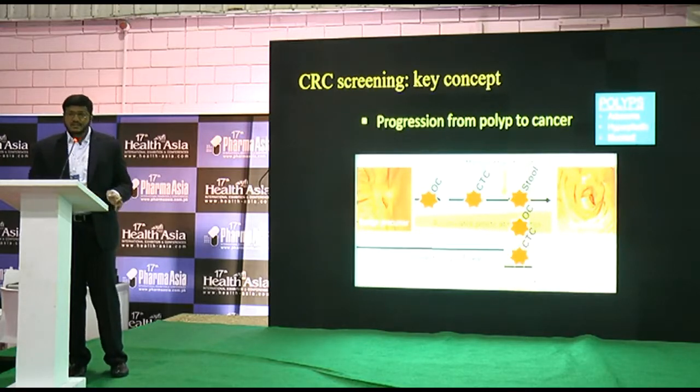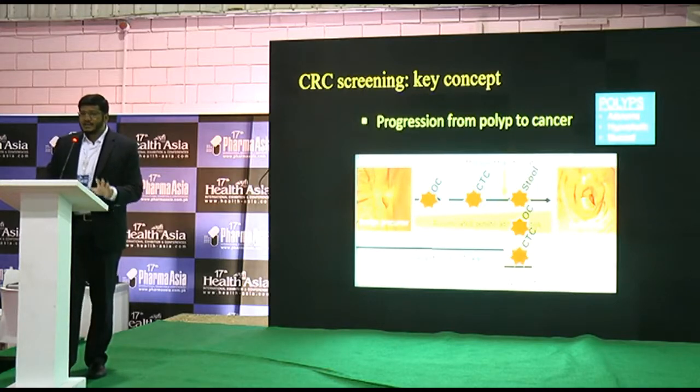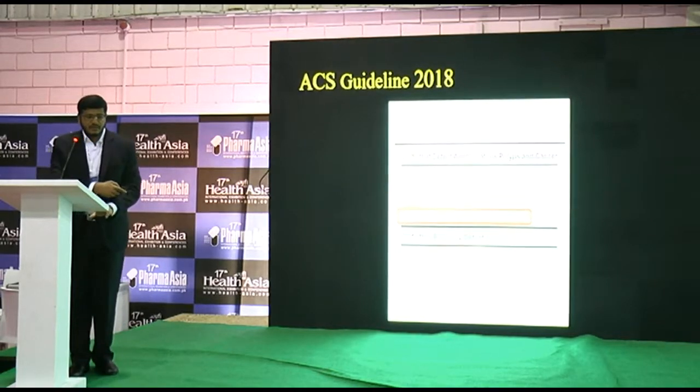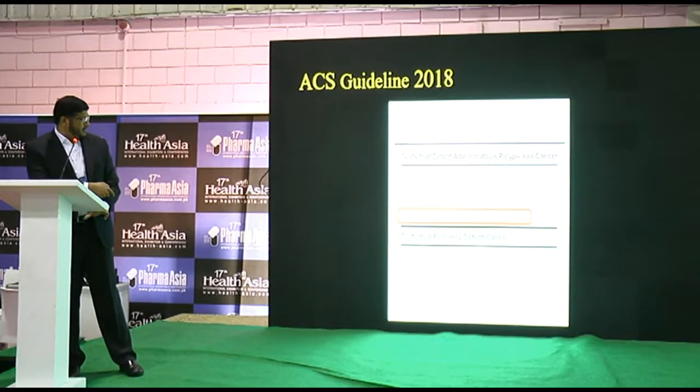If we see CTC, which is CT colonography, it also works in both the windows of cure and prevention. The advantage is that it is a CT technique which is used for screening, and there is also less chance of complication or less risk involved in the procedure. So this is the American Cancer Society guideline in which CTC is recommended for the screening of colorectal cancer.